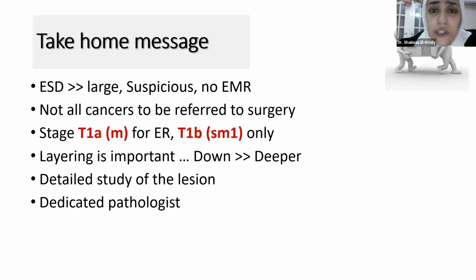So my take-home message is that ESD is for large lesions, suspicious lesions, lesions where EMR cannot be performed. It's no longer that all cancers are referred to surgery, because we see a lot of malpractice where patients with carcinoma in situ, after removing it, go for surgery. It's not for surgery from the very beginning.